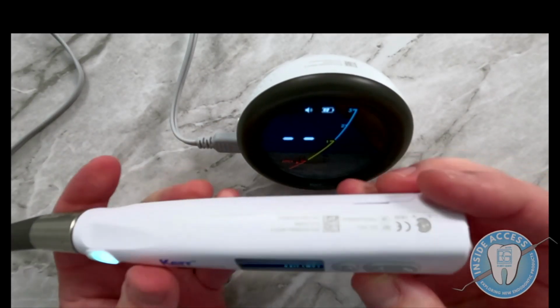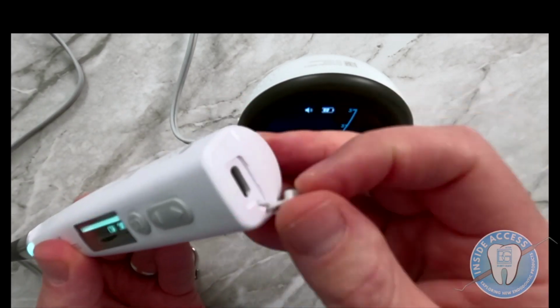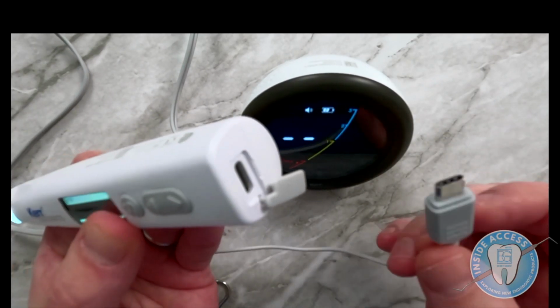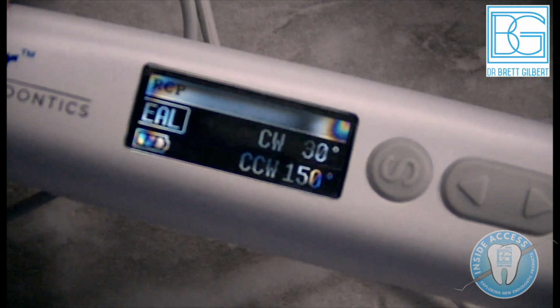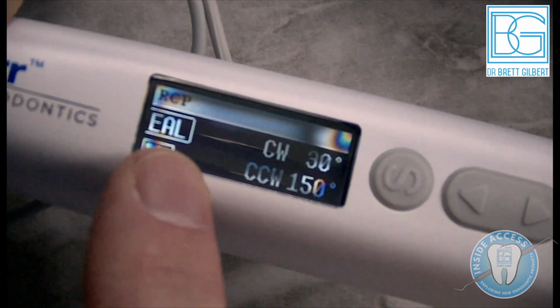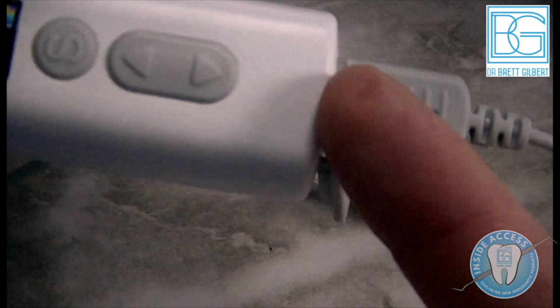Okay, and so the way that these two work together and connect, Apex Connect and Elements Connect, is you have a little port on the bottom of the motor here. And that will be where, instead of doing the file clip or the file probe, you would actually connect the two together. Okay, so when I set this up together in the Connect mode, what you'll see is it says EAL. So this is letting me know that the Apex locator, the Apex Connect, is actually connected.